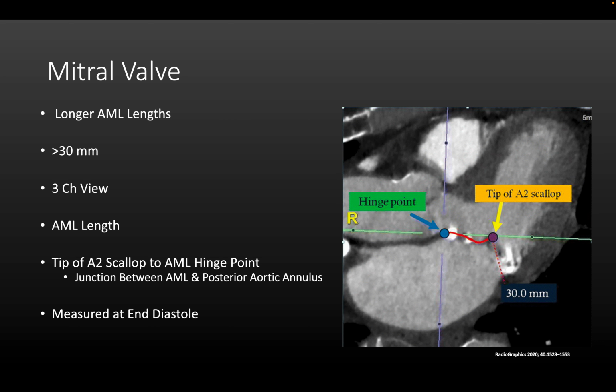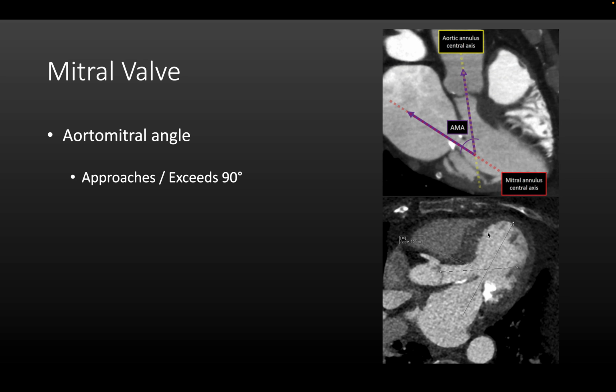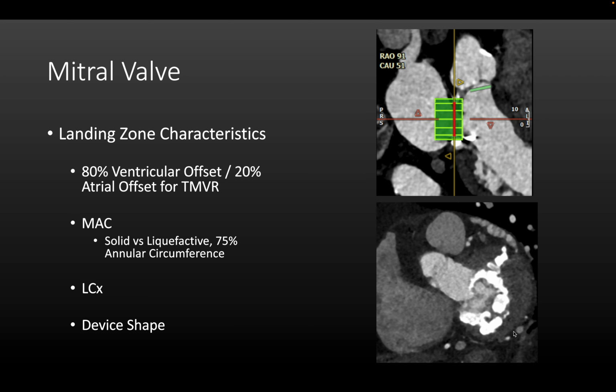Again, native, when it comes to mitral replacement, there are certain measurements that come out from the CT in order to guide whether that is suitable for the percutaneous solution or not. And there are certain angles with certain measurements describing how much is the calcification. Is the calcification going inside the myocardium? We could offline simulate the valve, and whether that valve will obstruct the outflow tract or not.